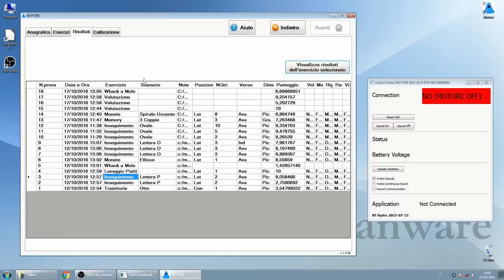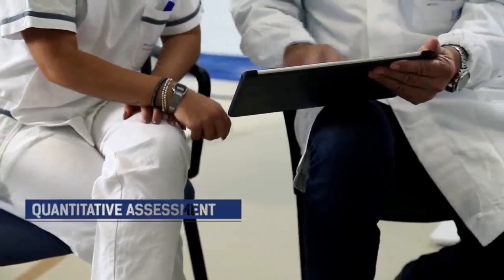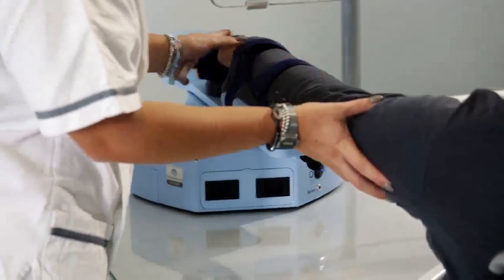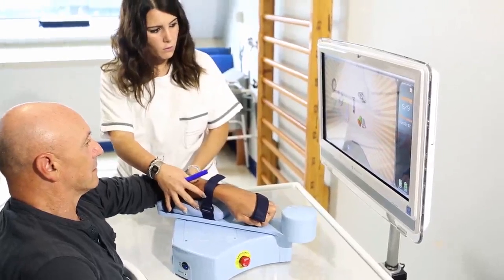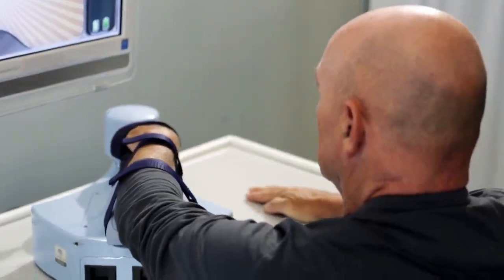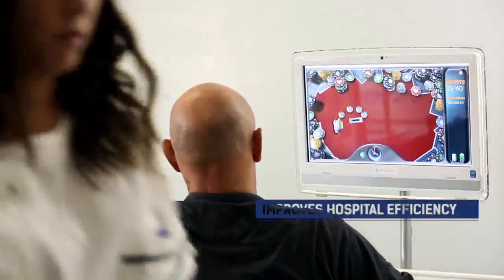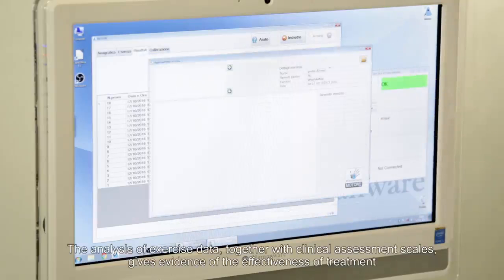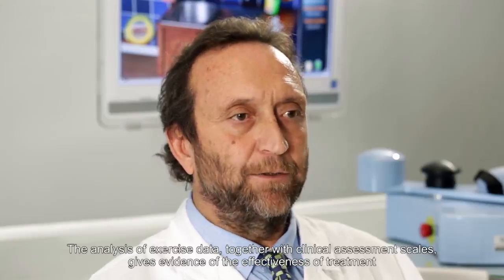During the therapy, position, speed, acceleration, and forces are all monitored and recorded for an accurate assessment of the degree of functional recovery. Being able to measure patients' progress means that the therapist is also able to adjust the parameters for the exercises to get the best from the treatment. The patients perform exercises autonomously with the help of the robot, meaning one therapist can follow several patients at the same time. The same tests performed after the treatment will allow us, in addition to clinical scales, to objectively evaluate the efficacy of the treatment itself.